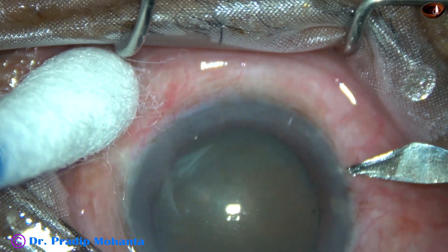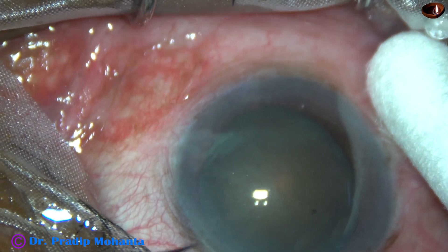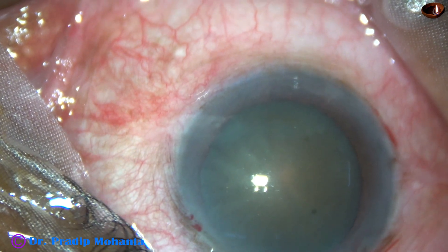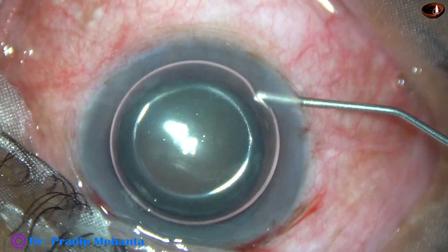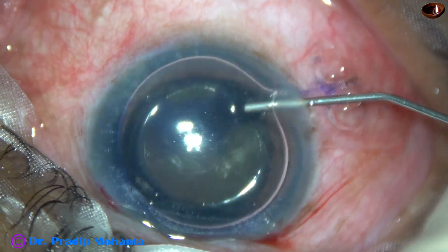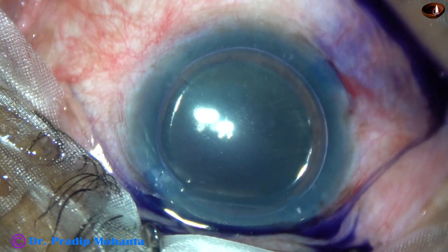In such cases, we expect only peripheral vision. We tell the patient about the prognosis that central vision will not be there, and the patient knows about it so that in the postoperative period, we don't face a lot of questions. Having explained the prognosis, I have taken up this case for surgery.